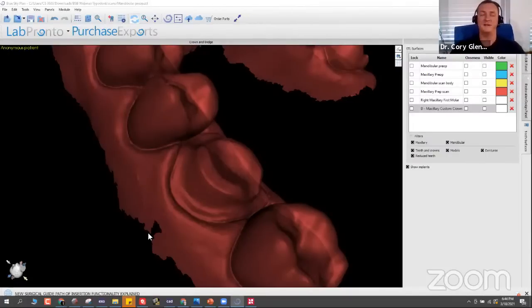It's really clean prints. It's somewhat of a closed system because you can only print their materials, but they actually have this permanent crown and bridge material. The downside with Form 3 is that it's using a single point laser to cure things, so it'll be a little slower. Some people say the prints are a little smoother because of that. But one pro that they have is, since all of their resins are verified and you only print their resins, I very rarely have a failure. So I would say either of those are a really great option. And then also SprintRay has the Pro 55, which is a smaller build plate size and just higher resolution.